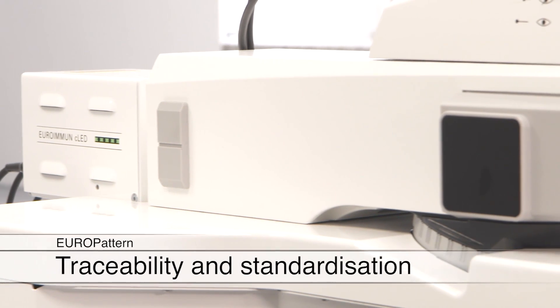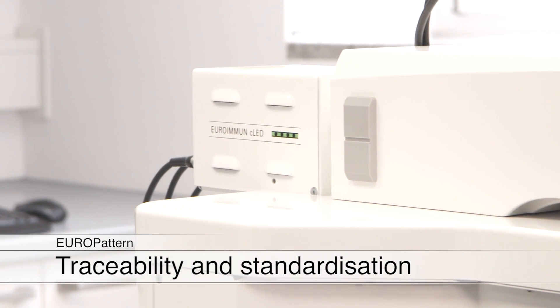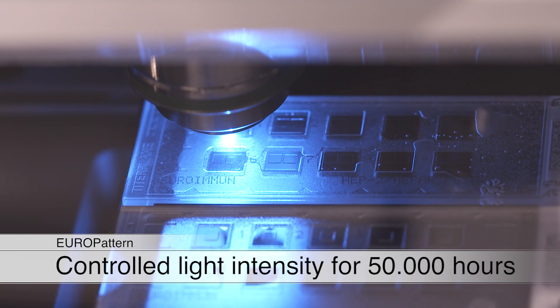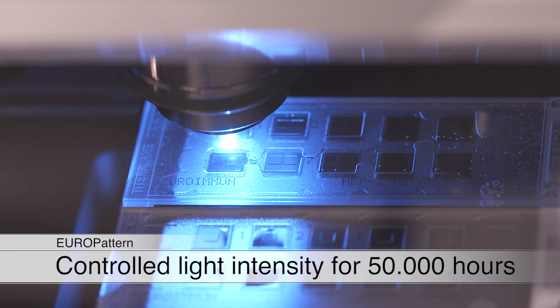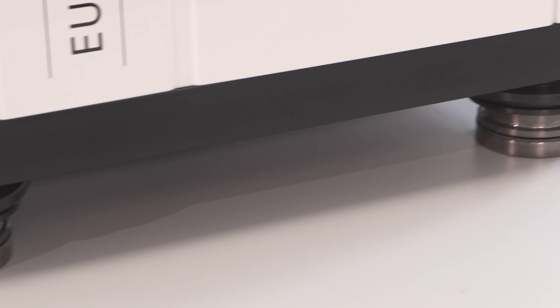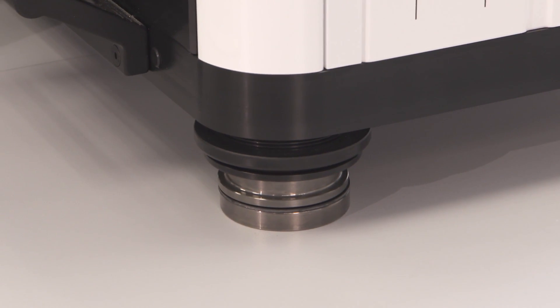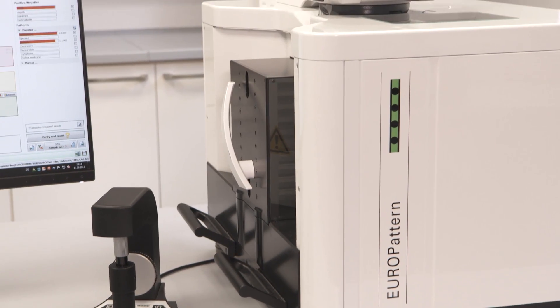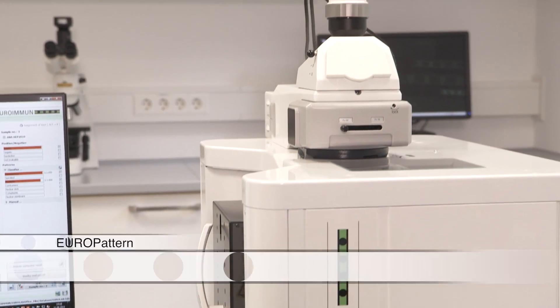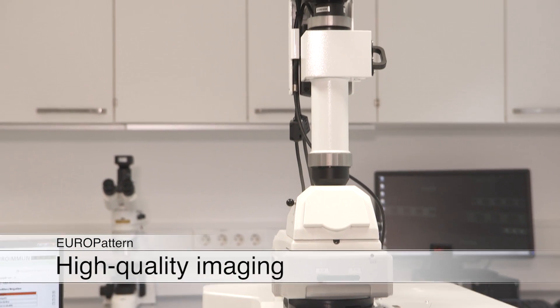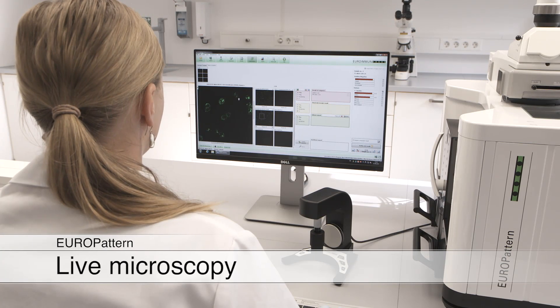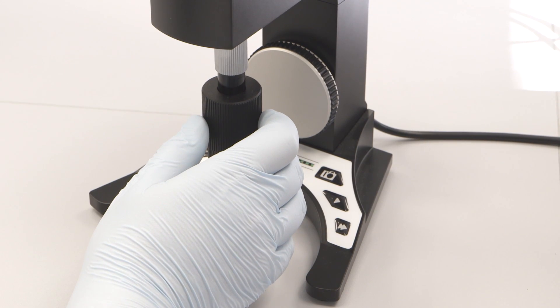The self-calibrating Euroimmune CLED guarantees a constant light intensity for over 50,000 hours of work. Vibration dampers, high-quality optics, and the double camera system provide for excellent image quality and highest speed of 18 seconds per field or 200 fields per hour respectively.